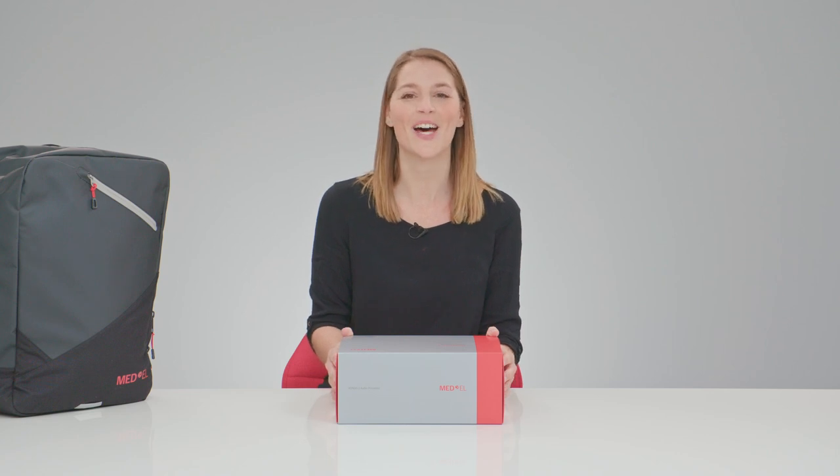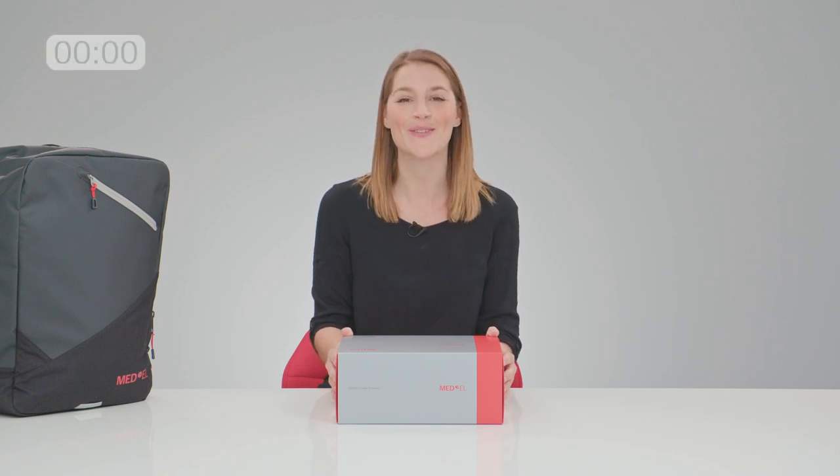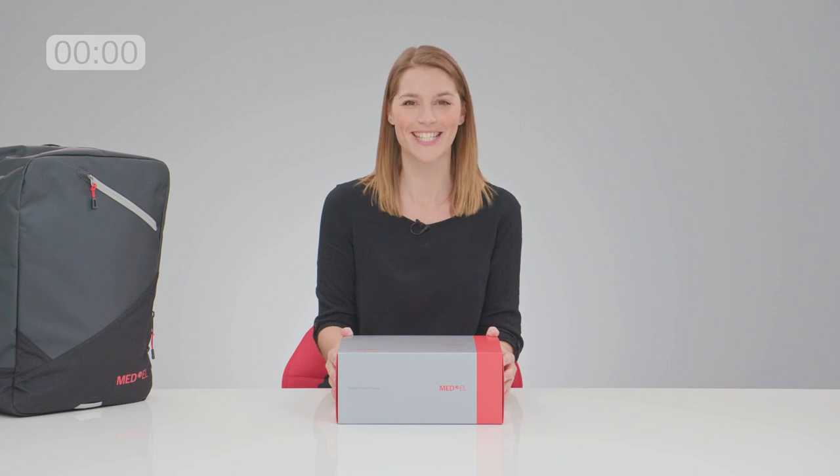Hi, I'm Nia from Medel, unboxing Rondo 3 in less than two minutes. Is that possible? Let's try.